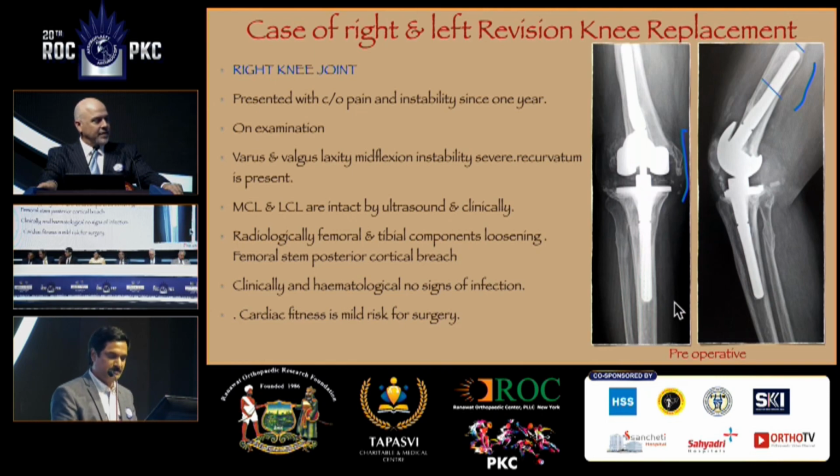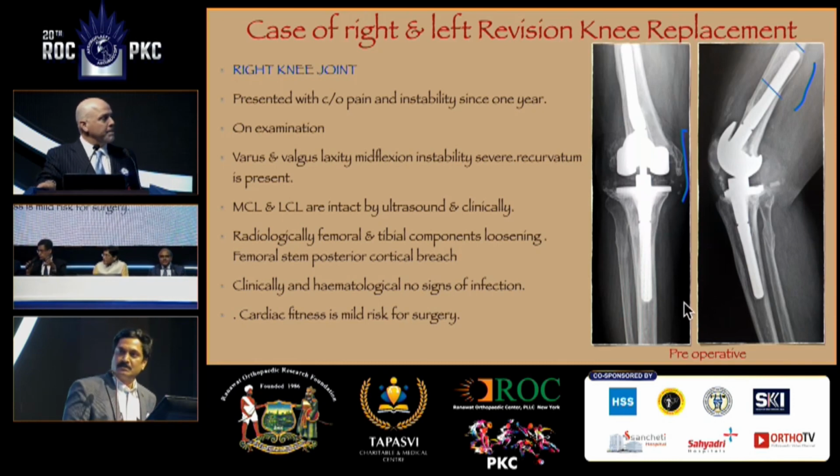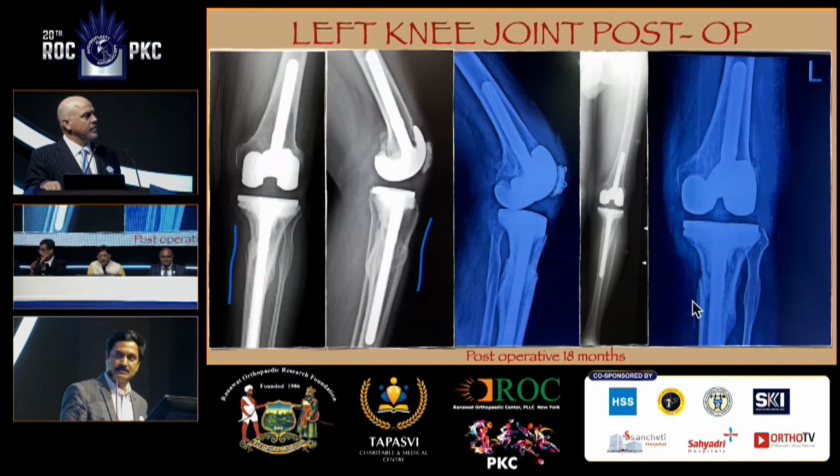He has used an external fixator. But the stem length which he has used for the tibia, he hardly has gone beyond the actual lower end of the fracture. How can that stabilize the fracture? I mean, it's good that it has healed. The patient is lucky. But I would be scared to just leave it like that with that short a stem, which has hardly gone not even an inch beyond that lower end of the fracture, and to expect it will heal without having a collapse.